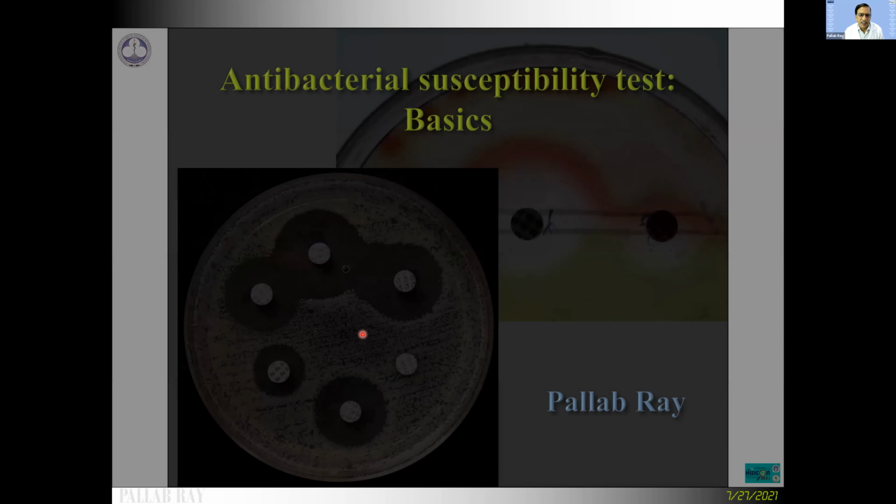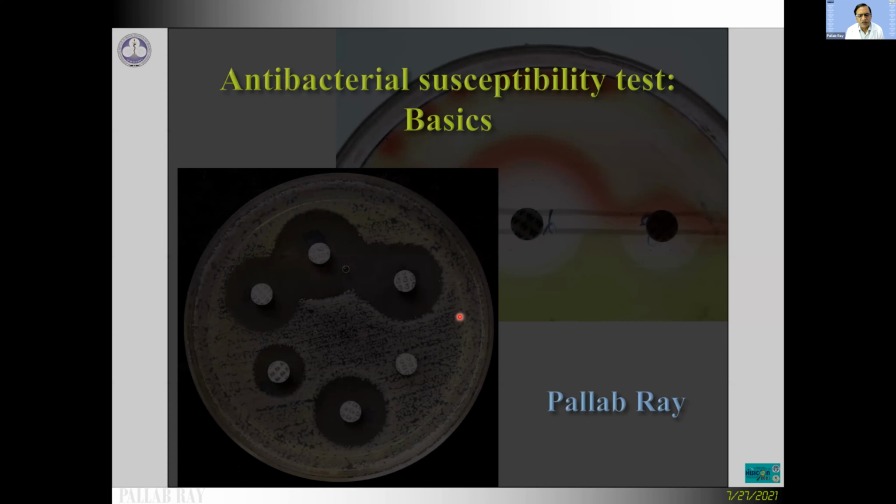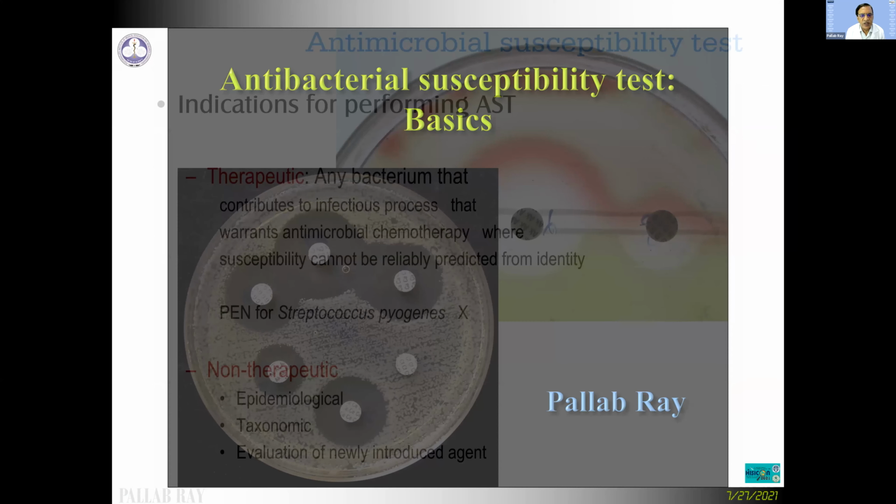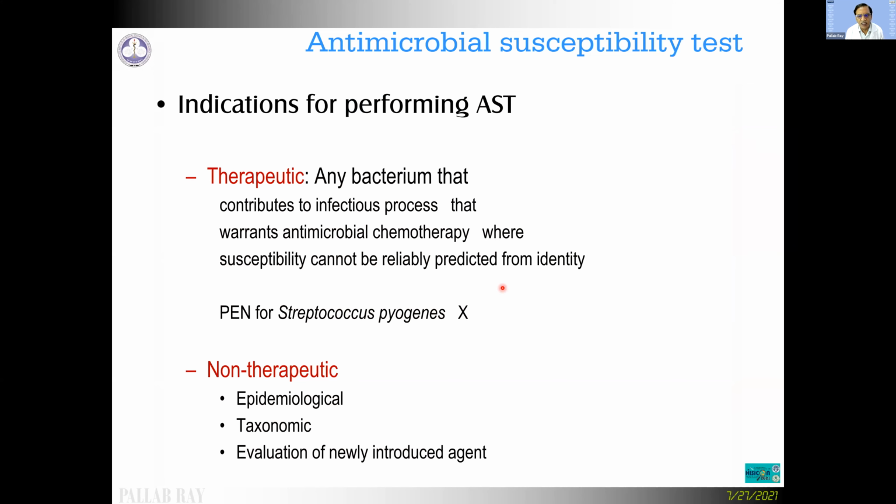Okay, fine. So I'll be talking about very, very ground basics about antibiotic susceptibility testing. And I'll start from when do we perform antibiotic susceptibility test? There are two different types of indications.